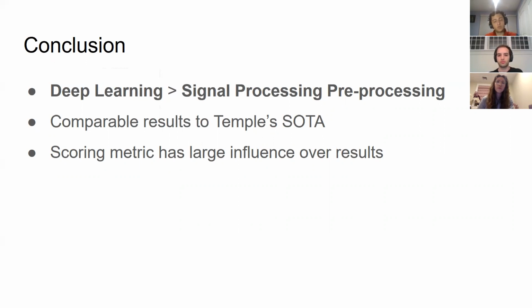So you see, we train with cross-entropy loss, but cross-entropy loss is not penalizing for what TAES penalizes us for, right? Which is how far off you are. In addition, their point metrics in their actual competition weighs the false alarms much higher than it does being correct or sensitivity. So these are things that we had to sort of take into consideration and settle.